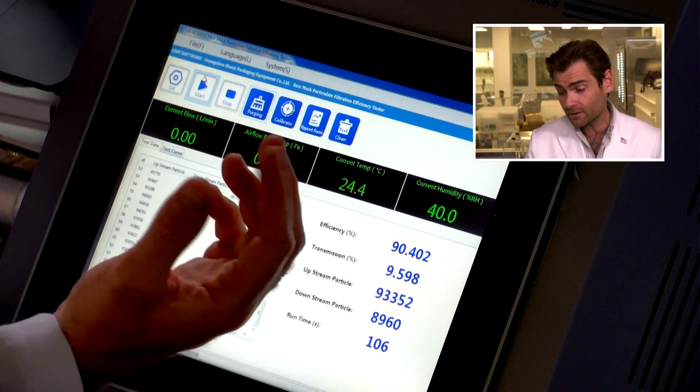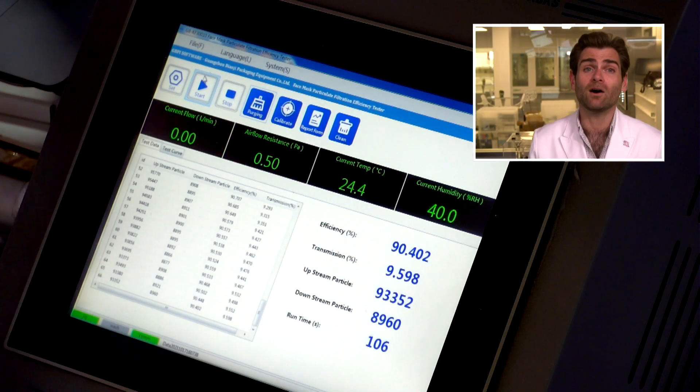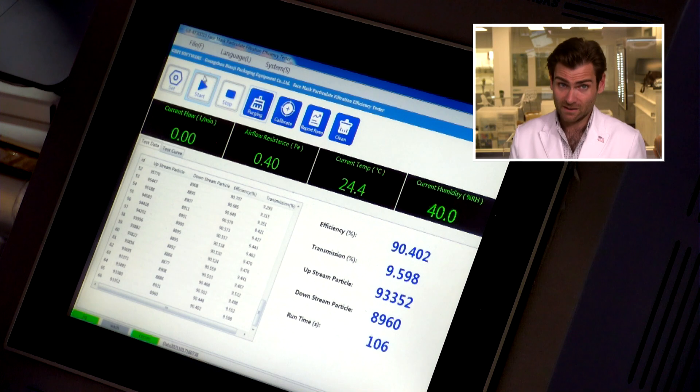Interesting design on the nose wire, but not terrible. It says 6 to 12 year olds, but I don't know if it would really fit a 12 year old — it barely fits my face.